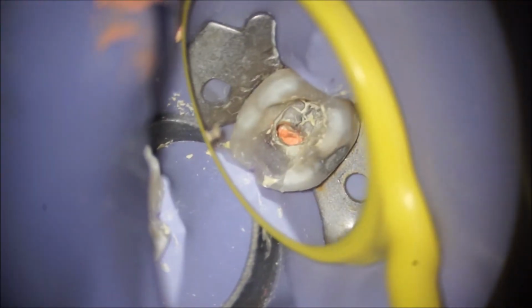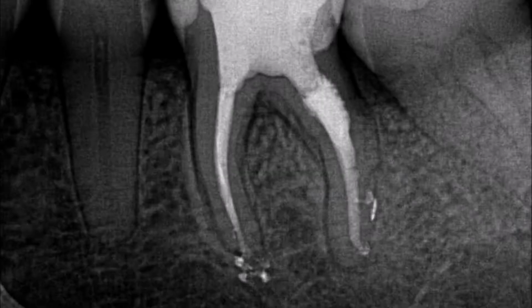And the coronal 2 or 3 millimeters of the canal are left open for a little bit of retention on the composite core that we did at the end. In the words of Cliff Ruddle, there it is, the thrill of the fill. A little lateral canal apical to the resorptive lesion reinforced what I said earlier about sealing the GP off at the bottom of the lesion before we started downpacking it. And also a nicely filled lesion space. Also note the little ramifications between the two mesial canals.